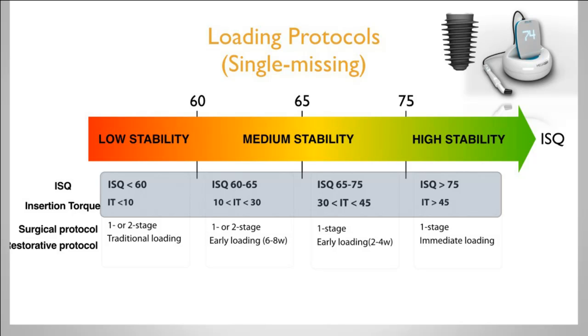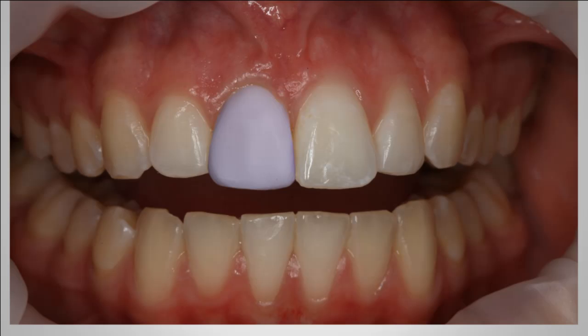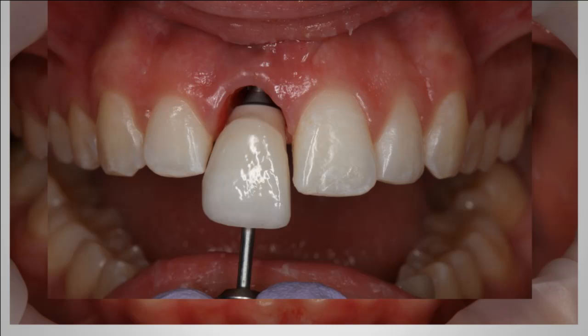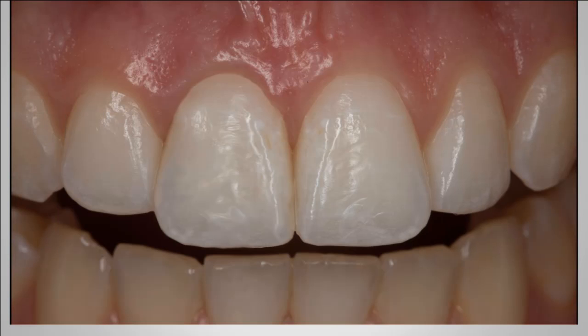Additionally, we can use ISQ to understand our loading stages, and we can control the outcome using a complete digital workflow. Here you see a CEREC Emax abutment restoration, finished, and this is the final outcome, chairside, all using CEREC.